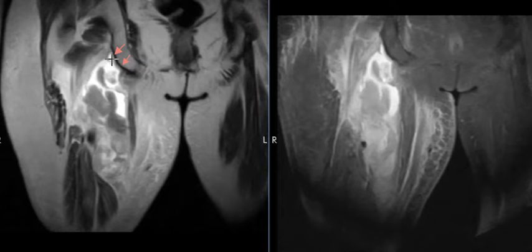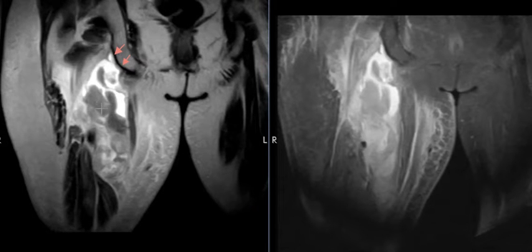Instead of seeing this nice dark tendon coming down here, like on this side, we see fluid in this crazy looking area of intermediate to dark signal, and these areas of bright signal. This is a big hematoma. So the hamstring muscles are down here, pulled back 1, 2, 3, and they come up here, and this is part of the hamstring tendon.